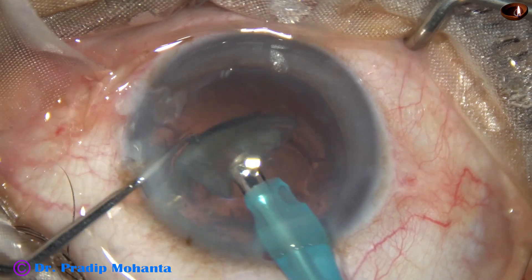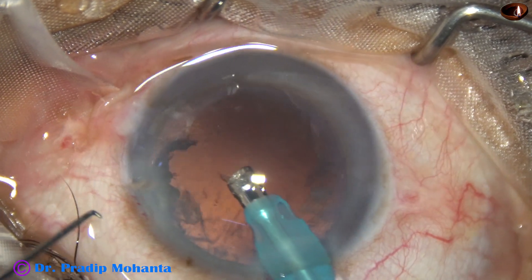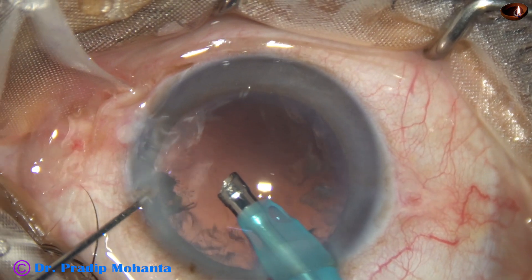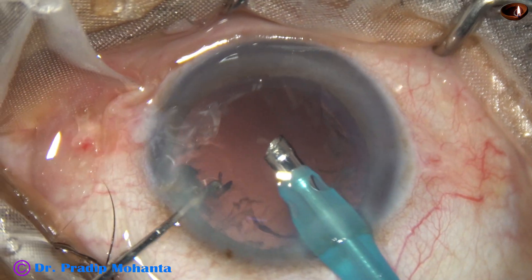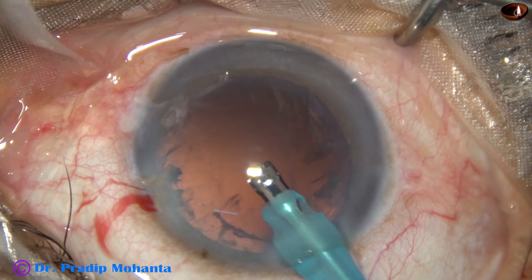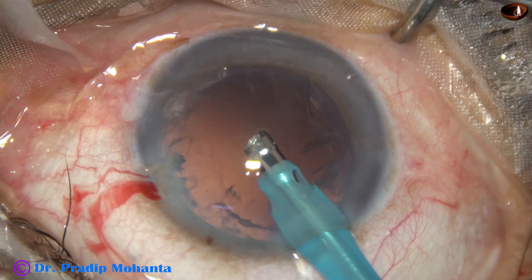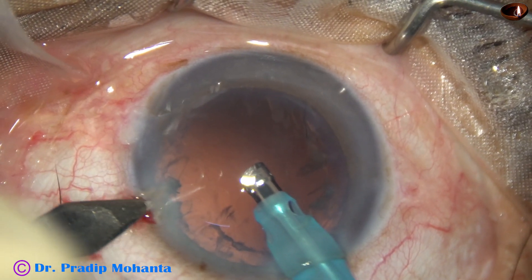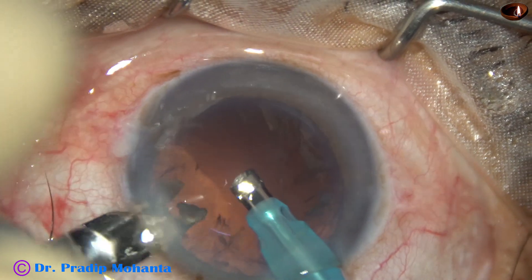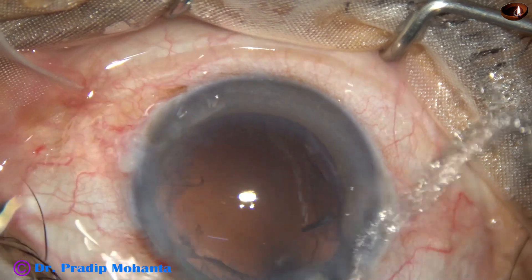Now the epinucleus is emulsified using low vacuum and low flow rate. There are some small nuclear pieces at the side port. I am going to enlarge the side port a little bit with a keratome and remove all the pieces through the side port.